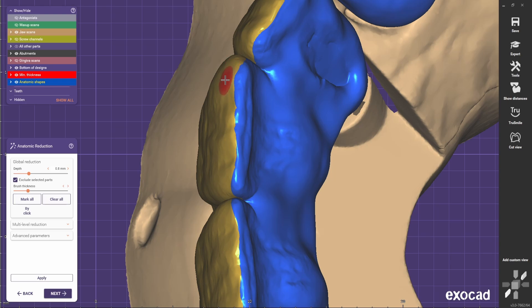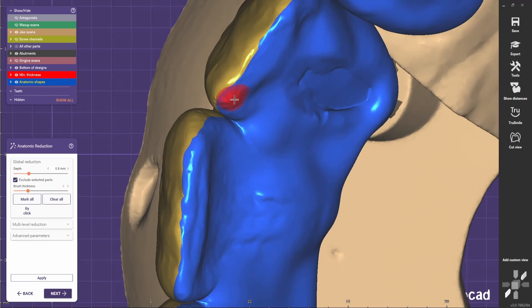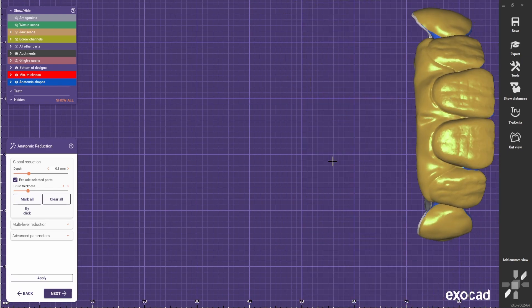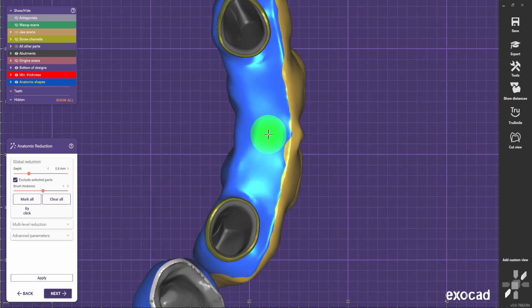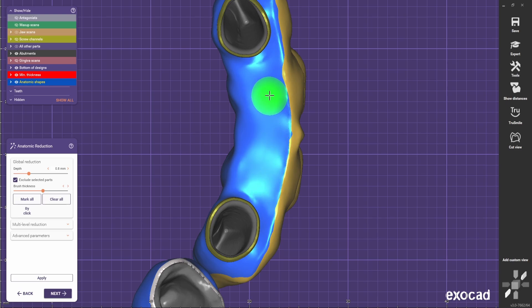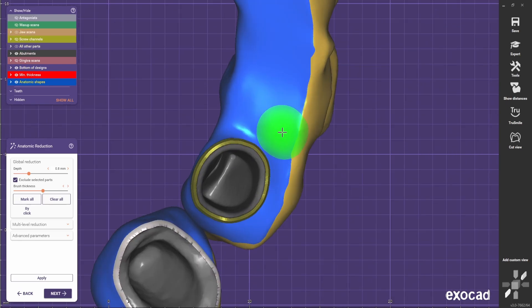I always like to keep the incisal edges in zirconia because it will protect the porcelain so it doesn't chip off. Leave the area that stays in contact with the soft tissue in full contour so you can polish the zirconia later on, which is the most biocompatible thing you can have.